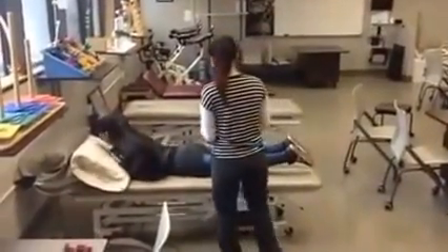To do the test, I'm going to use this goniometer. This goniometer is going to measure the number of degrees of your movement, and then I'm going to compare it to the normal population. Sounds good? Yeah.